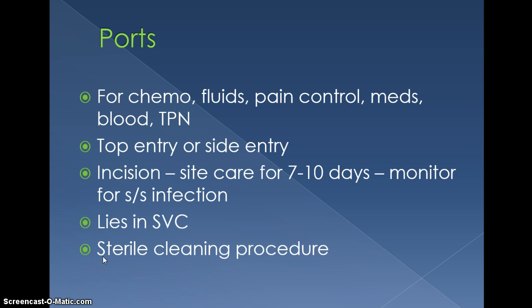The type of reservoir that's used is typically titanium, stainless steel, or molded plastic. It depends on the patient's therapeutic needs. So if a patient needs to undergo an MRI, they have to have titanium or plastic instead of stainless steel, so that you get valid test results.